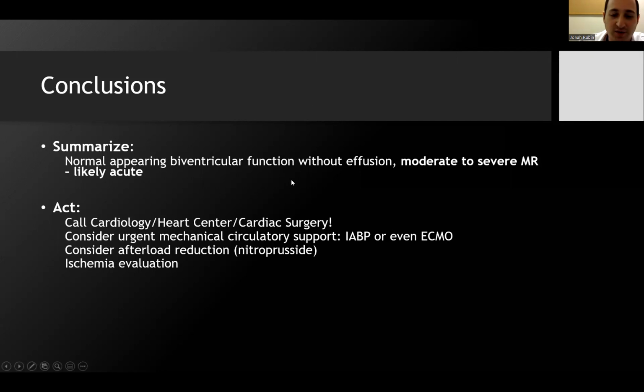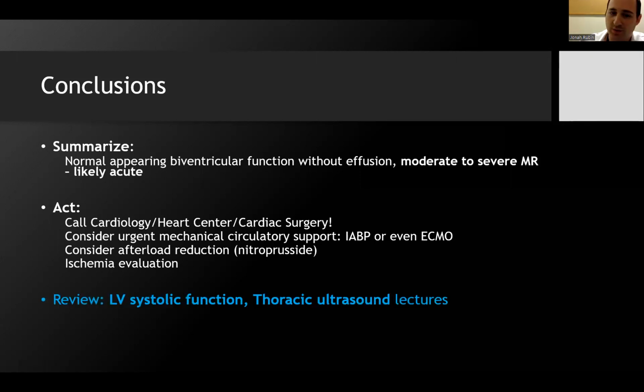But if you don't, you get an unremarkable echo, which you see in most of our patients who have some sort of shock that we can't otherwise explain. So just a shout out to look back at the LV systolic function lecture and the thoracic ultrasound lectures. I'm hoping that at some point, maybe next year, we'll do a lecture on valvular disease on POCUS. But for now, you don't even need an in-depth view of valvular disease to be able to recognize severe raging MR and to know that you should be calling the appropriate services.